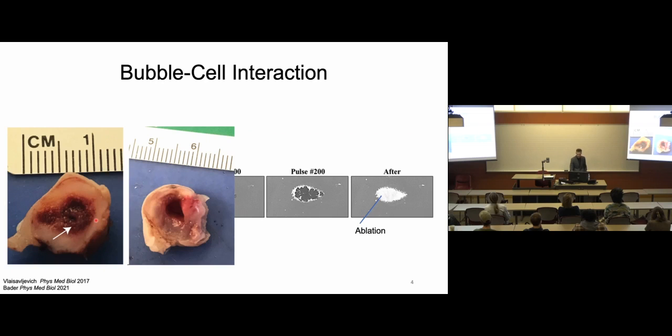Now this is a case where we've sectioned the tumor very well. Everything remains more or less intact. Here we applied a little bit too much pressure when we were sectioning the tumor, and the portion of the tumor that was ablated was simply aspirated out.